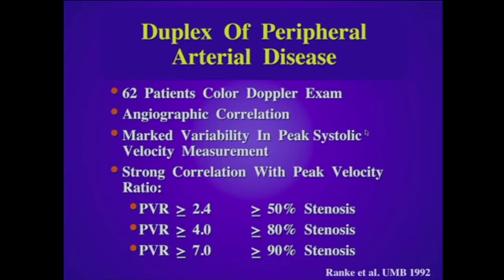This is important because we find that unlike the carotid evaluation, where peak systolic velocity measurements are utilized to classify arterial stenosis, this study showed that velocity ratios are more valuable for this evaluation. They were also able to correlate velocity ratios with increasing severity of stenosis.